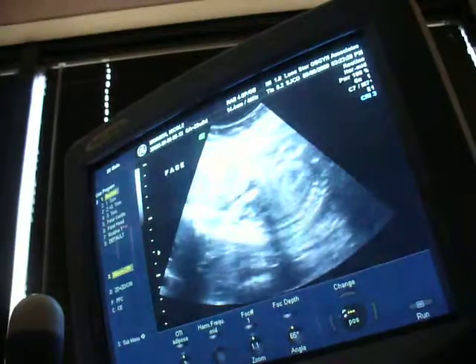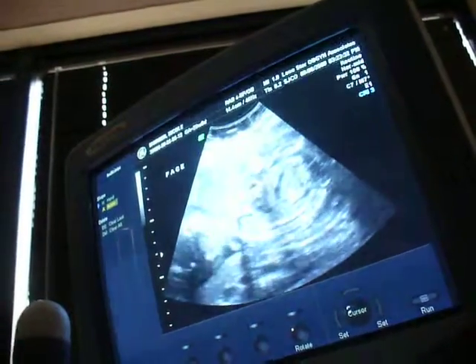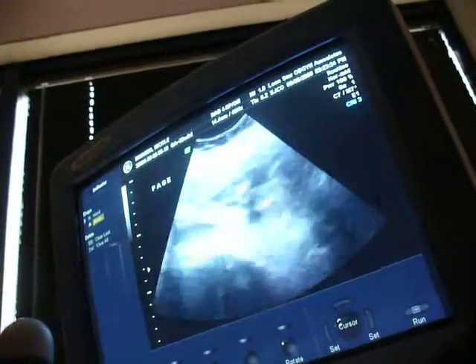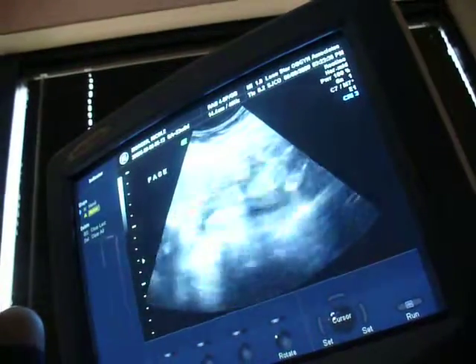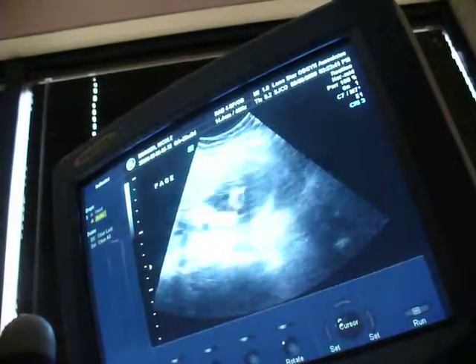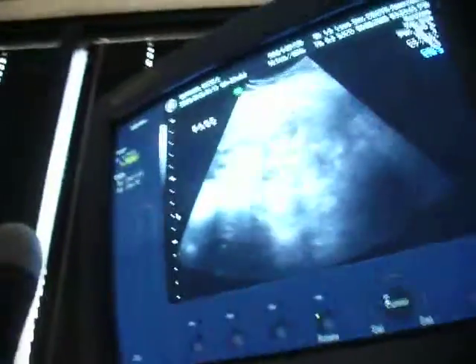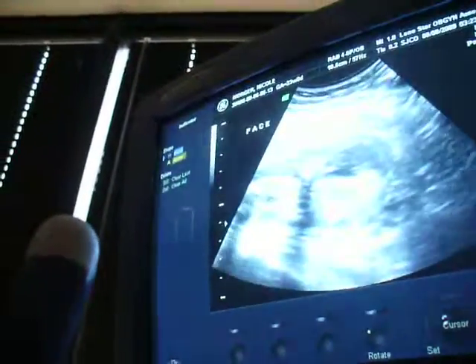We're going inside the body once again, seeing the spine here. There's the heart beating, front of the chest and belly. Now over here, we got this little leg stretched out there. And this one's kind of bent with the foot underneath this leg there. You see that little foot there? All right. Now let's blow that up so you can see what you're going to have.